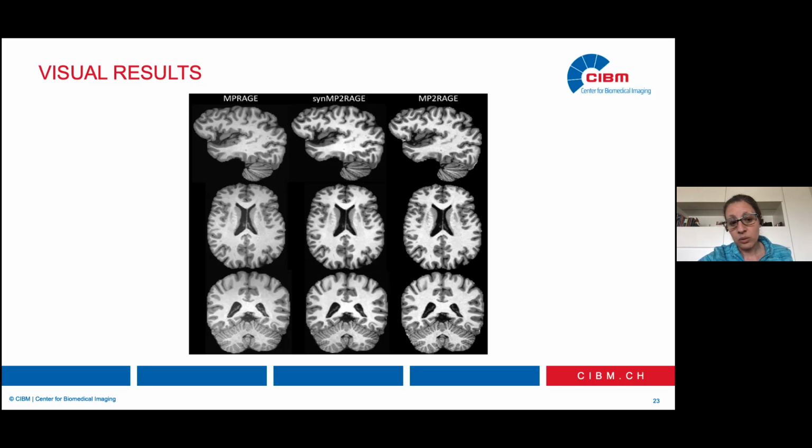It's more of a philosophical question, asking the technicians, neurologists and neuroradiologists to change their mind. Our collaboration with Basel, they are actually, if I'm not wrong, Francesco, correct me, only acquiring MP2-RAGE now. Yes, so they are very positive on that sequence. But indeed, this tool could also help studies using data acquired in the last years where MP2-RAGE was not considered. It could be a way of homogenizing the dataset, having a very similar MP2-RAGE that can be compared with the ones acquired from now on, hopefully in the clinics.